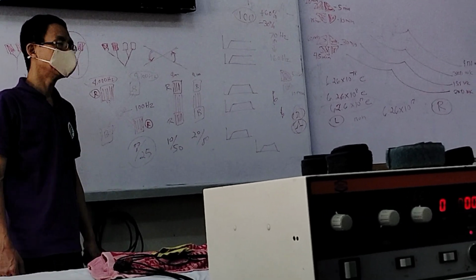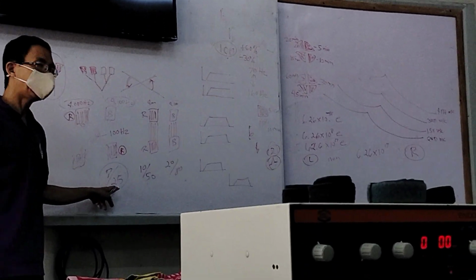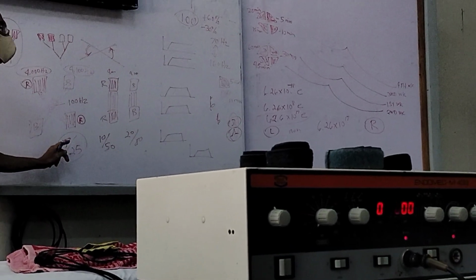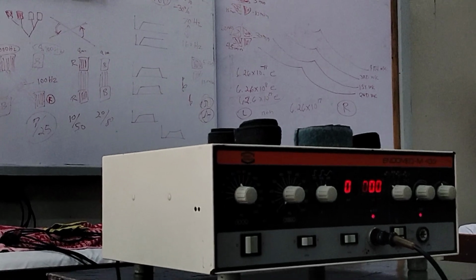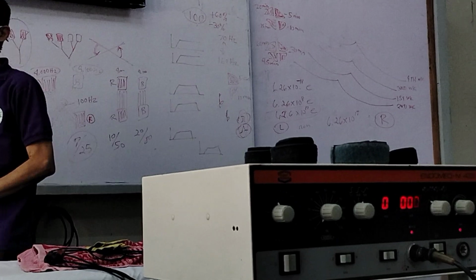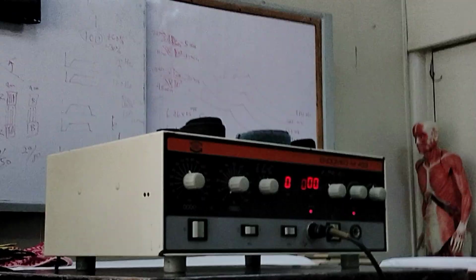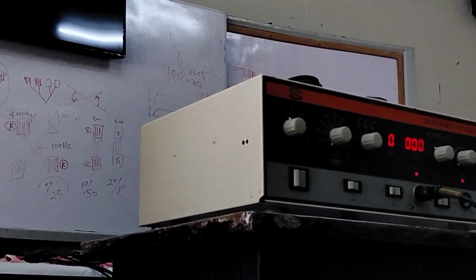So here, this will only be applicable if the type of contraction is synchronous or asynchronous. It is not applicable for continuous mode, since continuous has no rest.